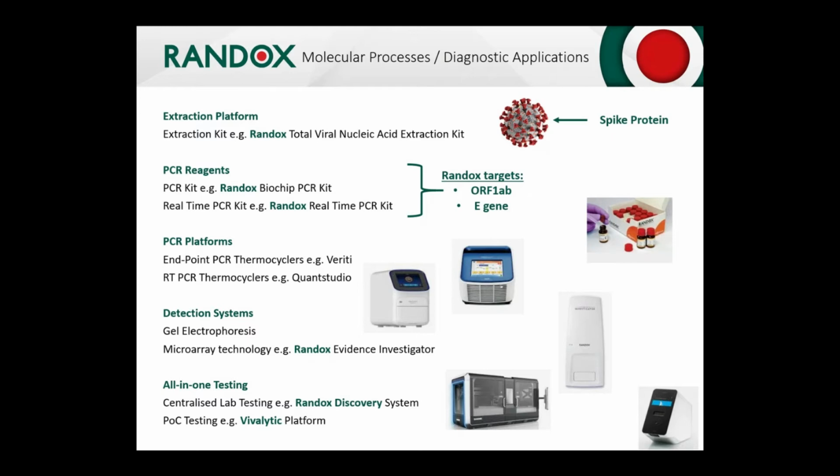After 30 to 45 minutes, depending on the cartridge that has been used, it produces a diagnostic report. Depending on the test that the clinician has requested, it can either be a qualitative PCR test, or it can be a quantitative PCR test, which would provide you amplification curves as well as a Cq or Cp value, which is indicative of the level of infection that patient might have. At the point of care, that's really impressive. The technology within the molecular diagnostics field is advancing at an exponential rate, and it's exciting to see treatment and testing being carried out potentially at the bedside, but also in airports.